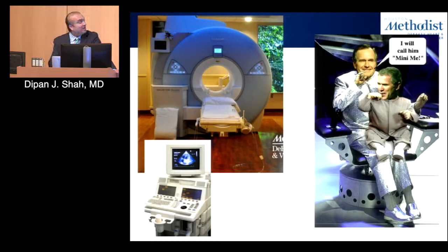So obviously you all know about the echo. Think of it as the big papa here. The MRI scanner is just like the one that you use to do brain imaging or knee imaging, but it requires special coils and special software. The patient lies on the table here and then goes inside the bore of the scanner. The typical acquisition time is about an hour or so.